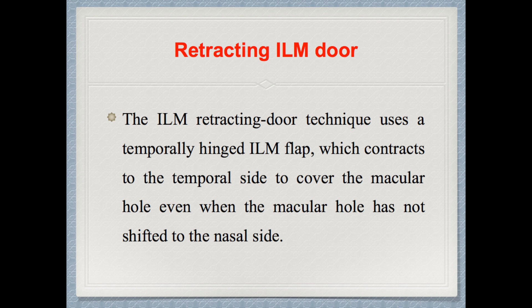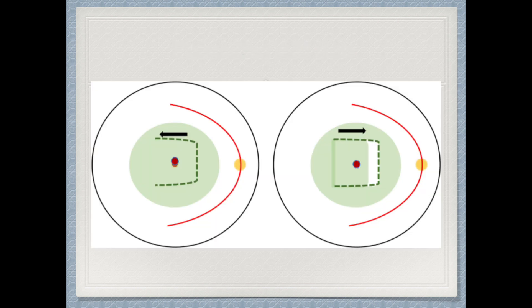The third technique is the retracting ILM door. The ILM retracting door technique uses a temporally hinged ILM flap which contracts to the temporal site to cover the macular hole, even though the macular hole has not shifted to the nasal site. The ILM is peeled from the nasal to the temporal site, and then left to retract back to cover the macular hole. This is mostly relevant to myopic macular holes.